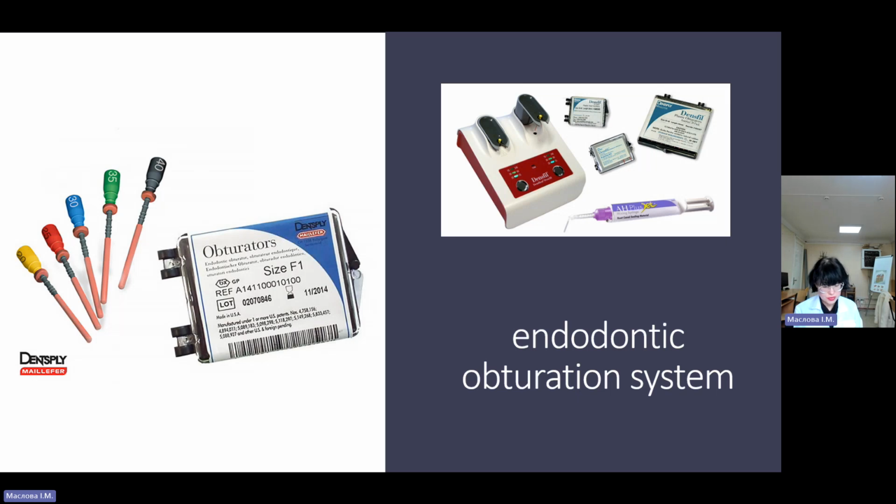According to their manufacturer, it contains a gutta-percha matrix embedded with 5% chlorhexidine diacetate. Studies investigating the antimicrobial activity of Active Points concluded that they don't possess an inhibitory activity strong enough to completely eliminate a moderately large number of Enterococcus microorganisms from infected human dentinal tubules.